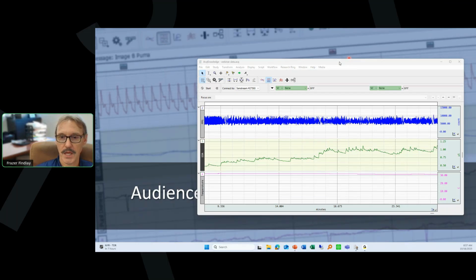Does all of that very nicely. Now, as you became aware while you were watching that, there's actually quite a few steps in that process. You start with making sure that the signals are clean, you remove any artifact that may be in there, then you start to run the automated analysis routines.